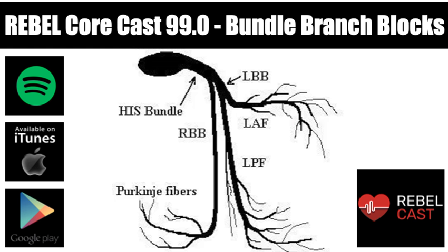This is Swami, and today we're going to be talking about bundle branch blocks. Something pretty basic in ECG interpretation, but important for us to have a good grasp of. A bundle branch block is an interruption of the normal conduction system, leading to aberrant conduction and an abnormal QRS morphology.